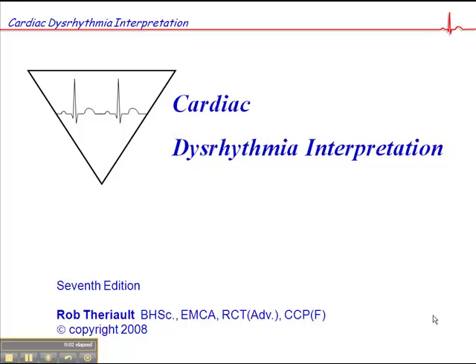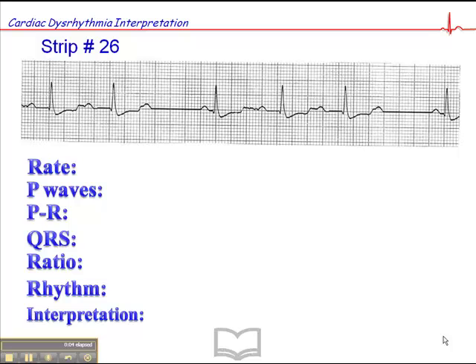We're on page 97, this is exercise 26, and we'll start by looking at the heart rate, which is approximately 72 beats per minute.